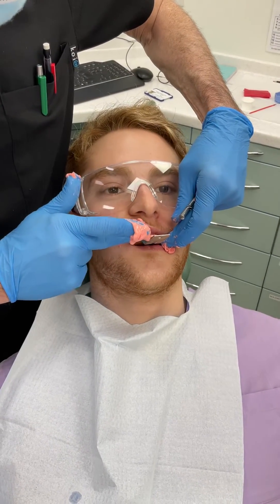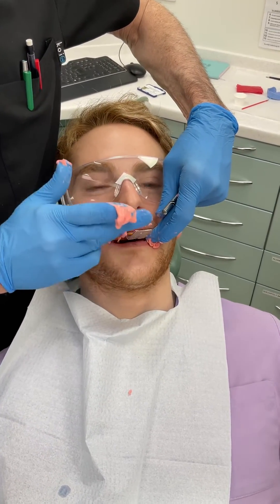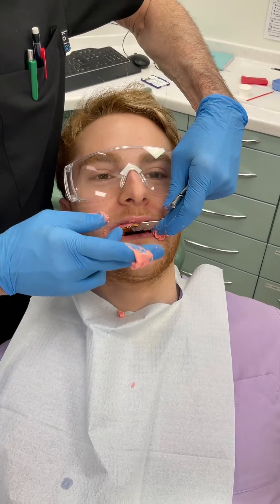Don't you love patients with facial hair and alginate? Let's make a mess, guys, look — it's worse with silicone and it's much worse with polyether.